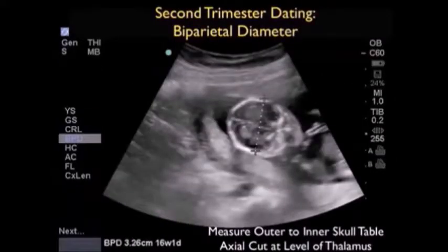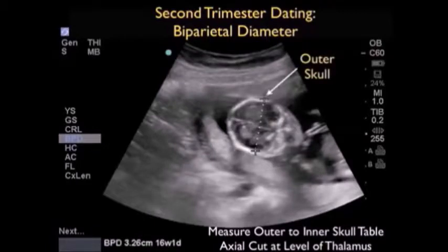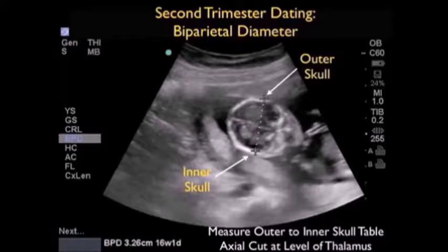In the second trimester, dating of gestational age focuses on skull circumference or measurement of the biparietal diameter. We want to measure the skull at about the level of the thalamus in an axial orientation with the face down. As we can see here, we're placing the calipers from the outer skull table proximally to the inner skull table distally, and we have a measurement of 3.26 centimeters correlating to a 16-week, one-day gestational age.